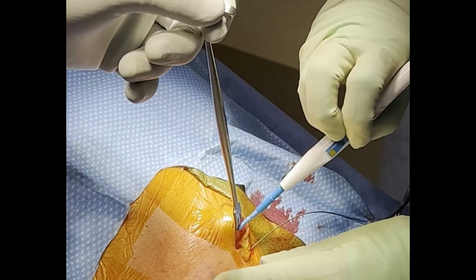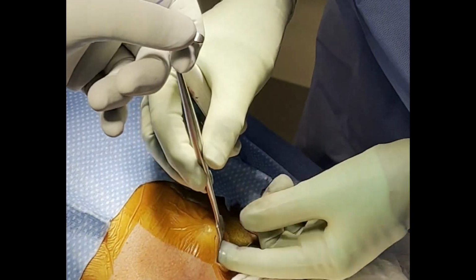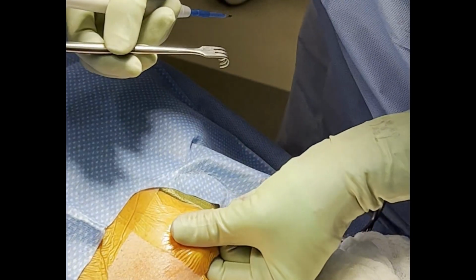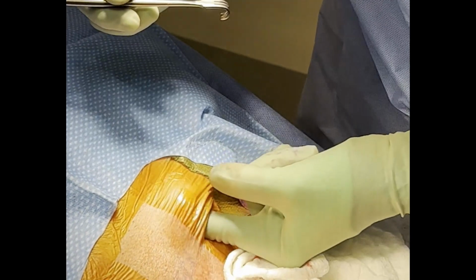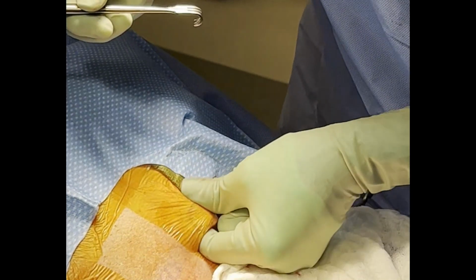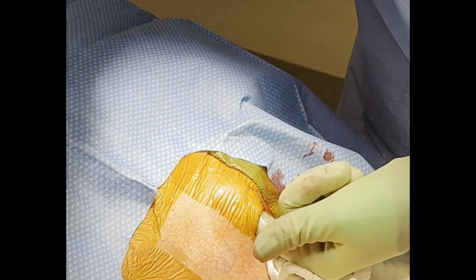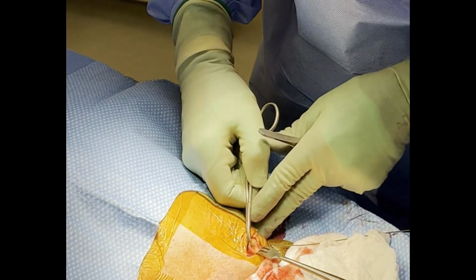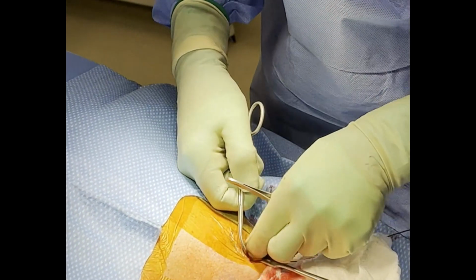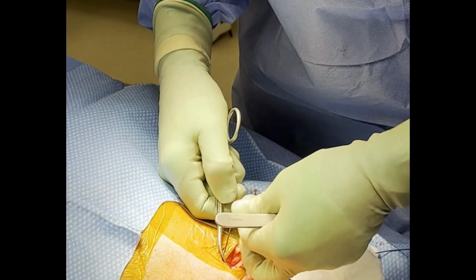Then create a skin flap along the inferior edge of your incision using blunt dissection and electrocautery. The trick here is to make sure that your flap is not too thick, which will cause access issues, and that the flap is not too thin, which can cause necrosis of the overlying skin. Next, use either a tunneling device or other methods to bring the guide wire into the pocket where the port will sit.